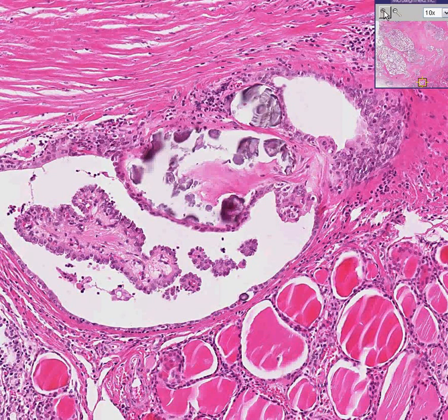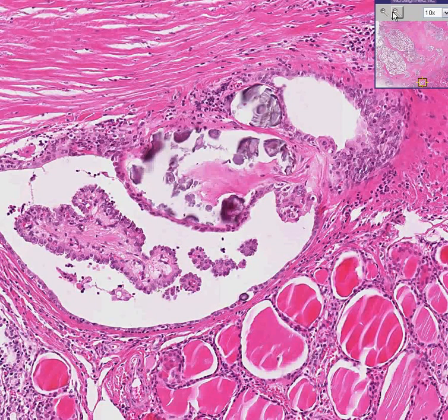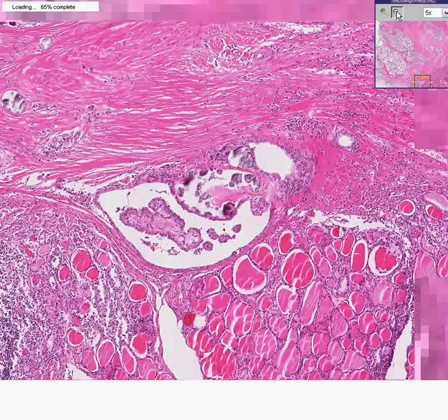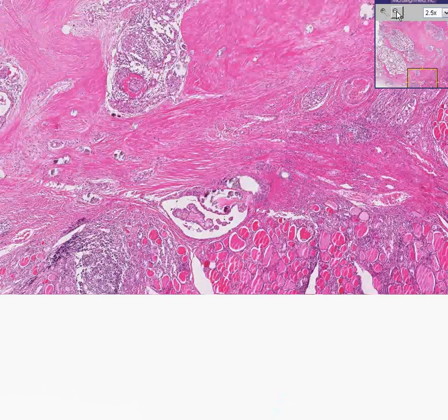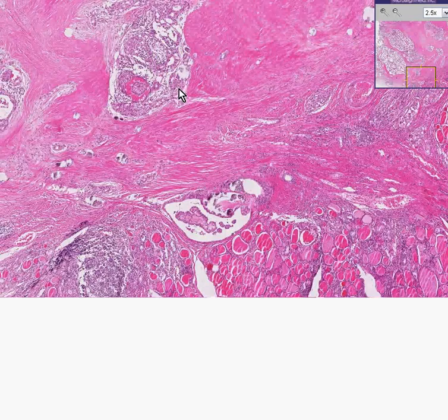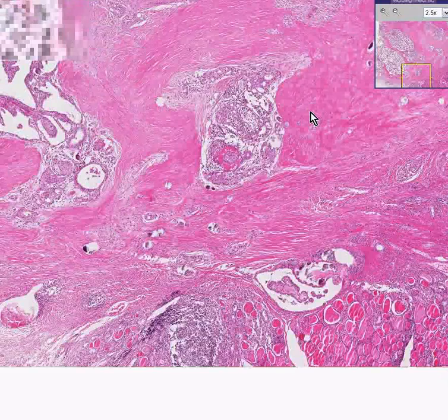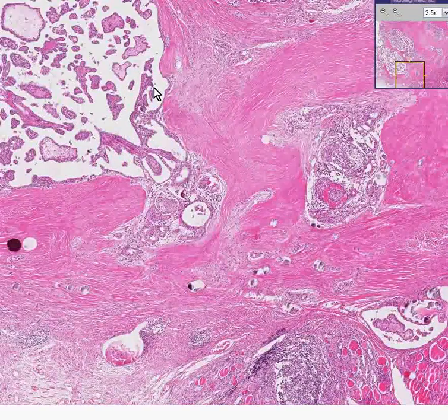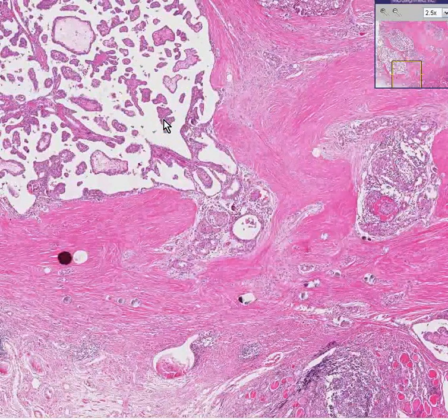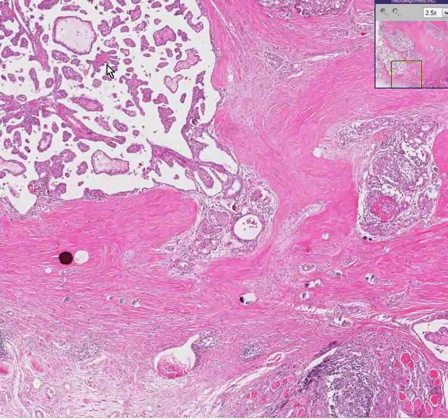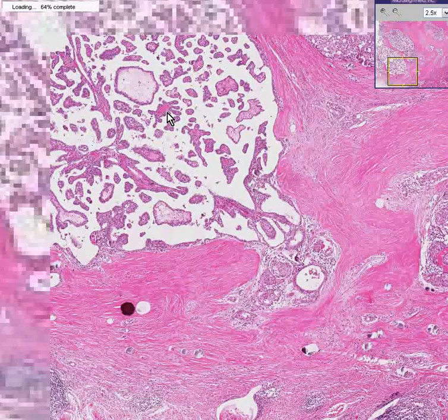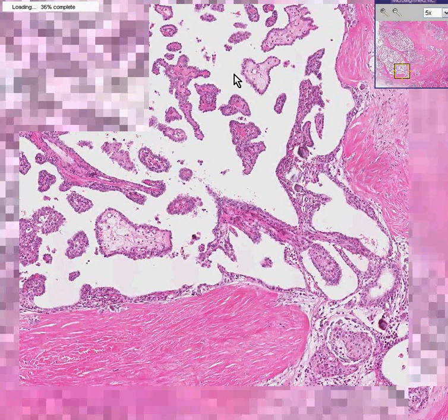Now let's make this very simple, and I hope not to hurt anybody's feelings or insult anybody's intelligence. Everything papillary in the thyroid is cancer. If there are papillary adenomas of the thyroid gland, nobody has enough guts to call it that. So to make a long story short, you don't have to go trying to find orphan Annie nuclei and invasion of this or that. Whenever you see anything in the thyroid gland that looks truly papillary — grossly or microscopically — you can diagnose cancer no matter what the thing is doing.